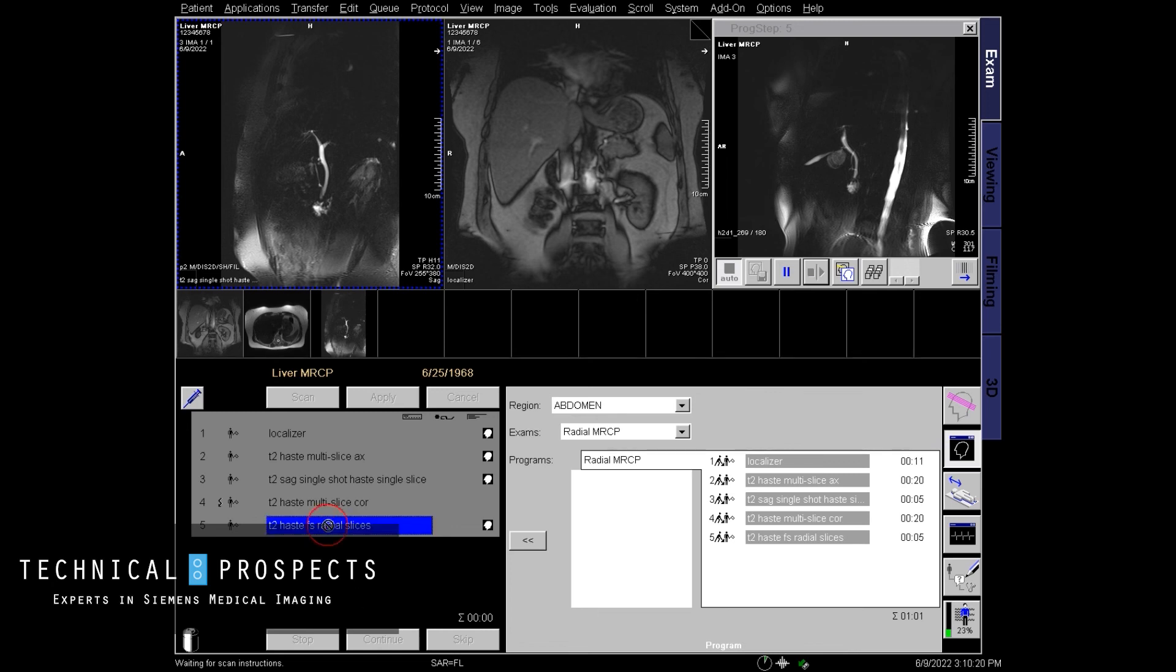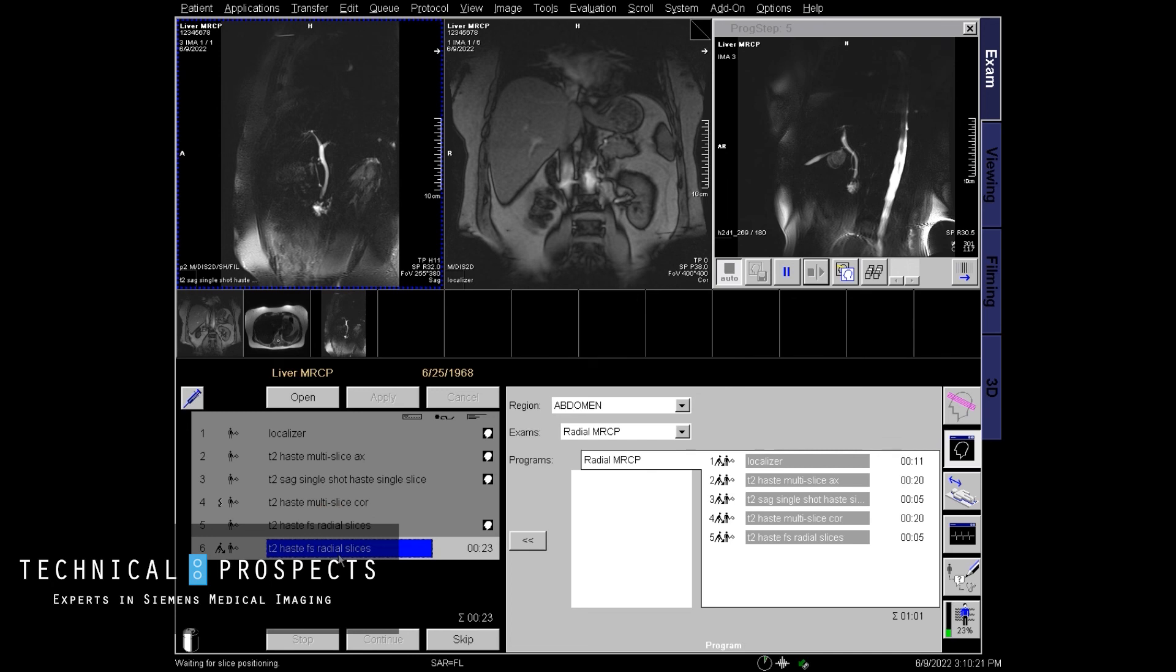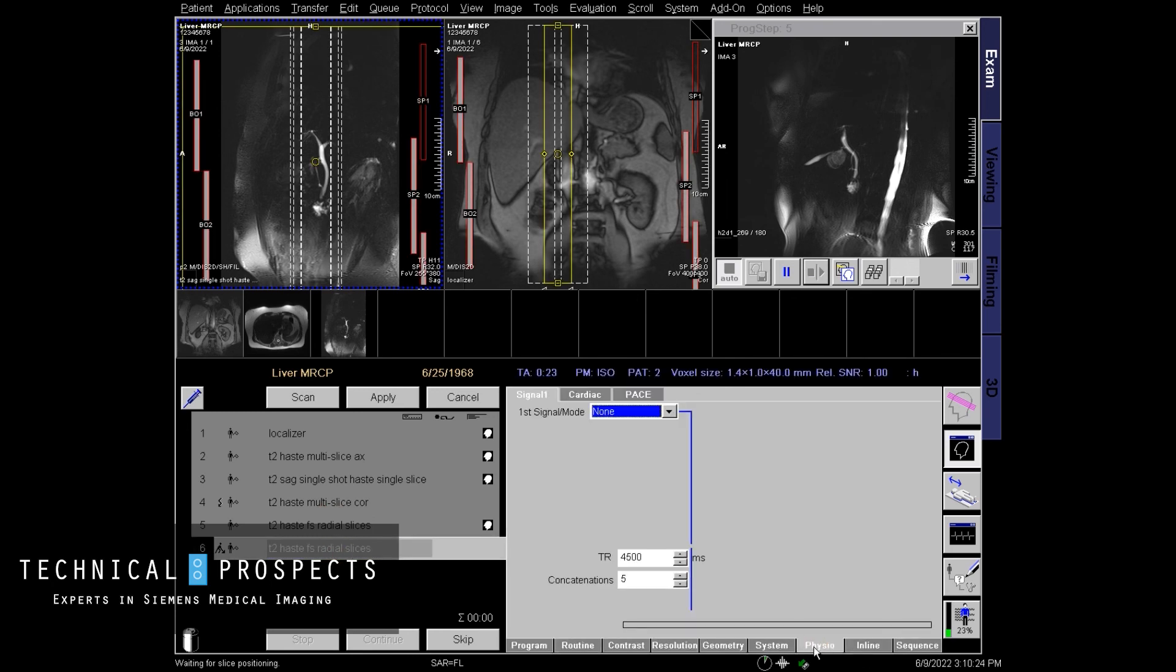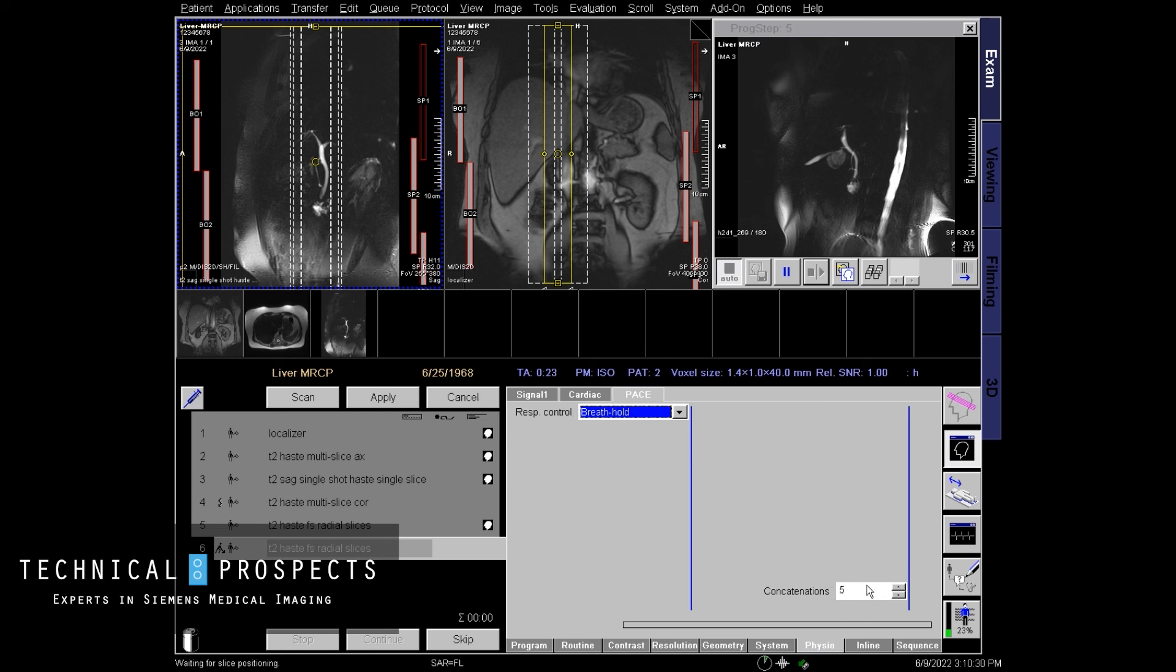The important part to remember is that when you do this, is that you go to physio, pace tab, select your breath hold and select your concatenations to match your slices. A lot of people forget this and then you're not going to be able to do this radially.